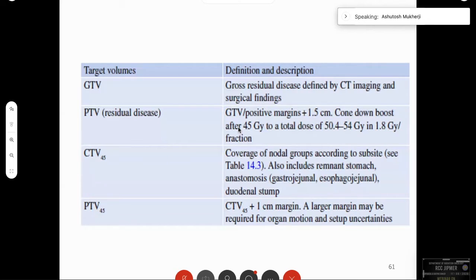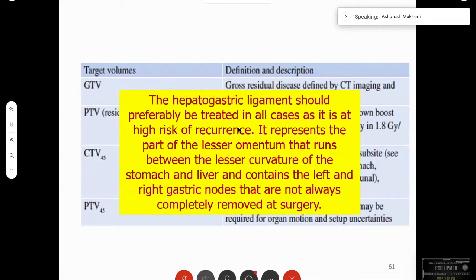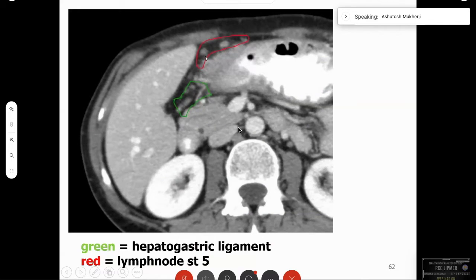The CTV nodal includes the remnant stomach, anastomosis, and nodal groups, with a 1 cm margin beyond. If not using motion management or IGRT, at least a 1 cm CTV-to-PTV margin is important. It is important to remember that the hepatogastric ligament must be treated in all cases, as it is a high-risk area for recurrence. It is the part of the omentum running between the lesser curvature of the stomach and the liver, containing the left and right gastric nodes which may not always be completely removed.